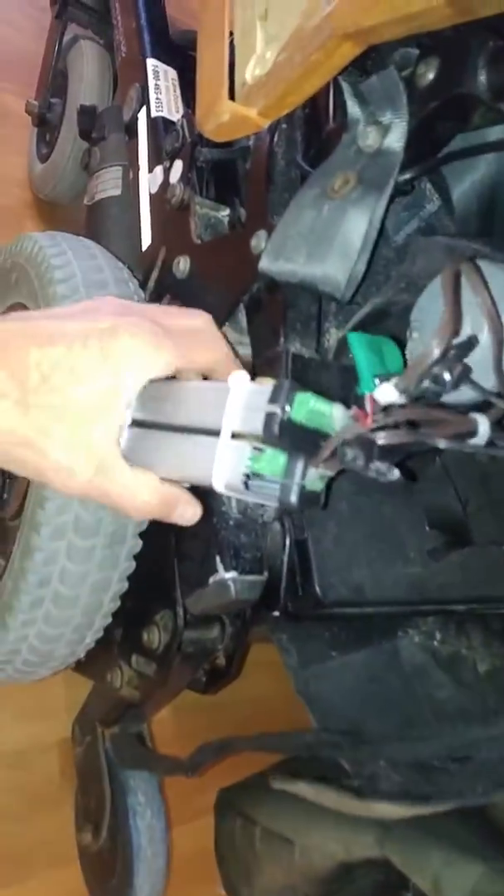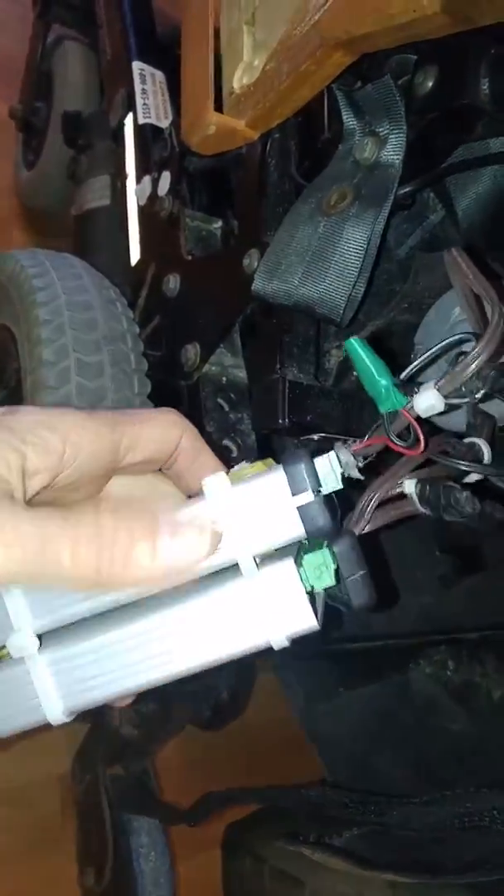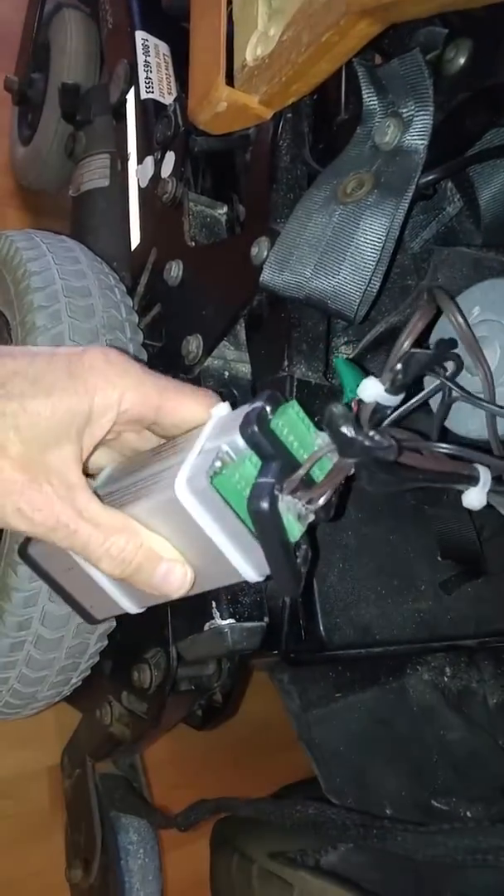On the other side of the chair is the power supply unit. Each of these boxes contains two adjustable power supplies.